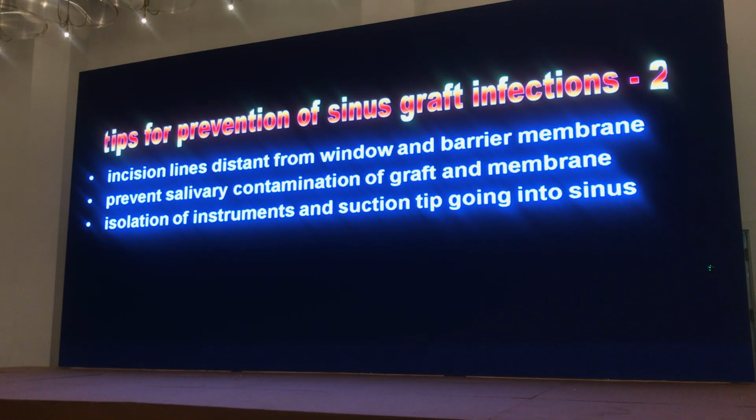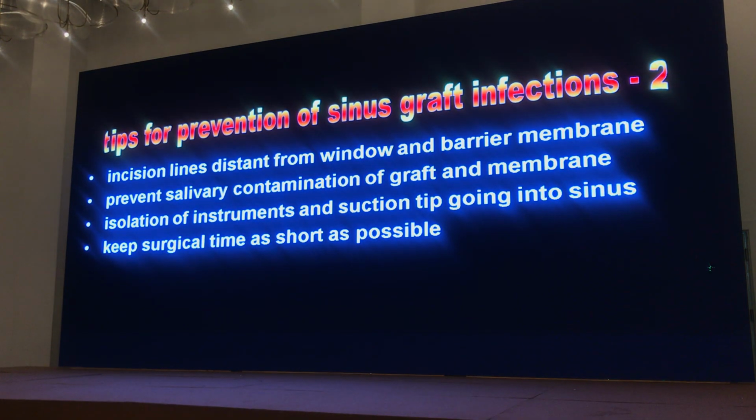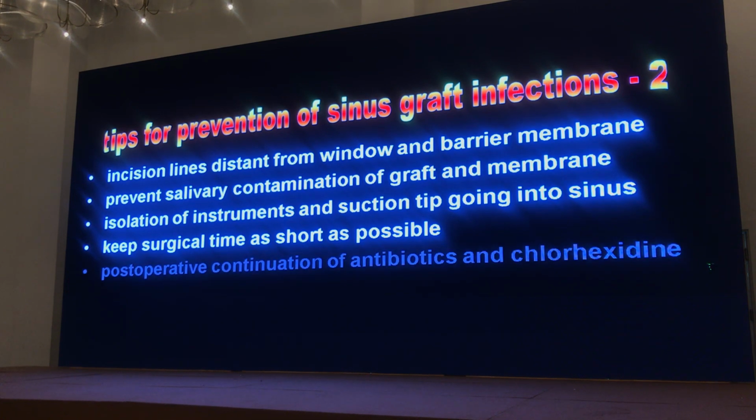We talked about 2 surgical kits, one for the sinus instruments and one for the instruments that are going in the mouth. Keep your surgical time as short as possible. This does not mean hurry. What this means is have everything there. Have your graft material, your membranes, everything you need right there so that you don't have to get it or send somebody to get it. It wastes time. And in medicine, they have studies that show the longer the procedure is open, the higher the infection rate, because you're not working in a sterile environment in the mouth. You want to get in and get out quickly.